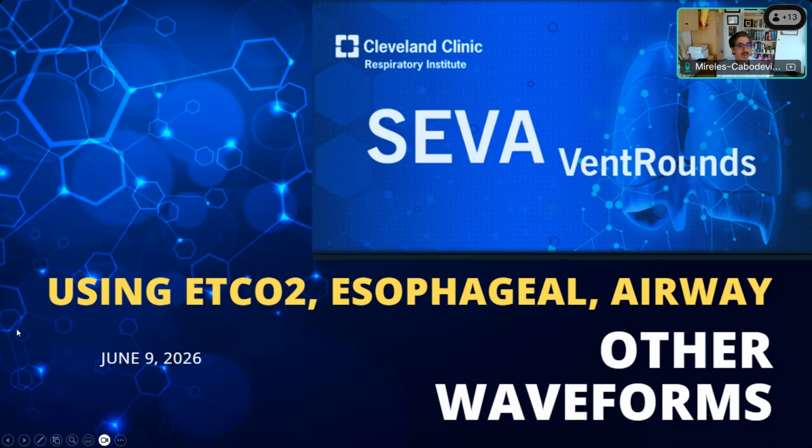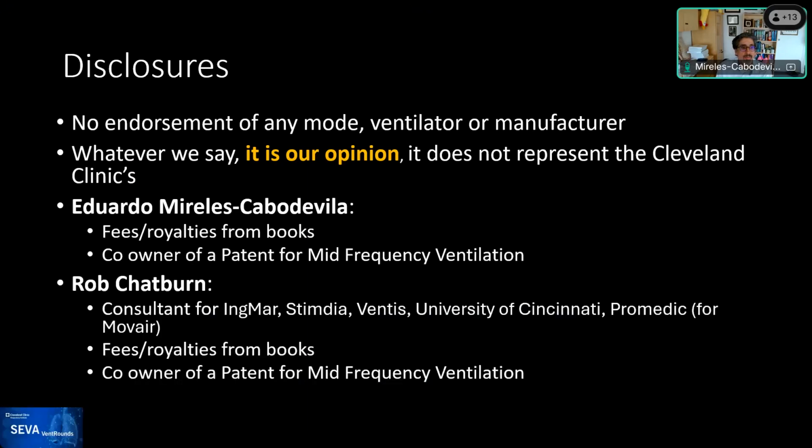We're going to do June 9th, 2026, and we're going to use other waveforms. The topic is using end-tidal CO2, esophageal, and airway to recognize the interactions. There is no endorsement of any mode, ventilator, or manufacturer. Whatever we say, it's our opinion, and it does not represent the Cleveland Clinic.